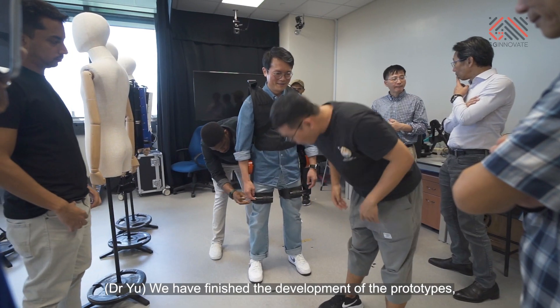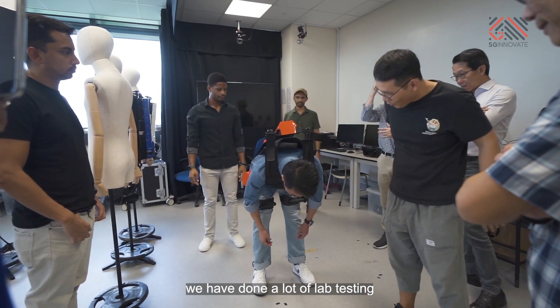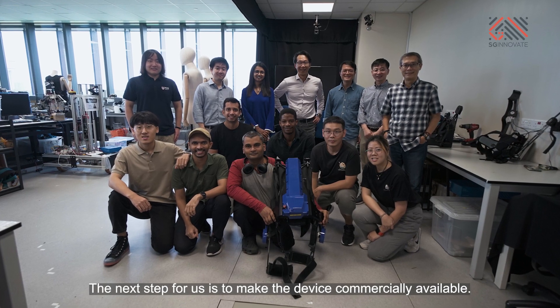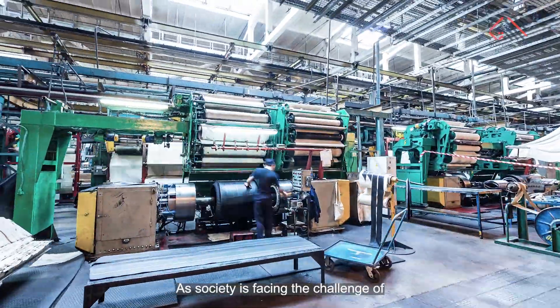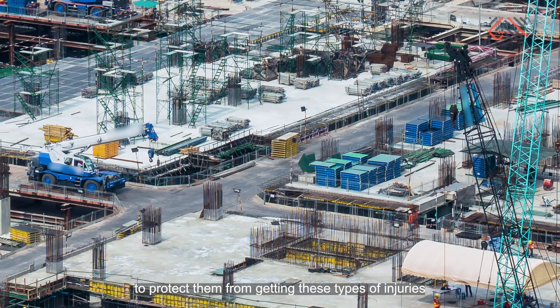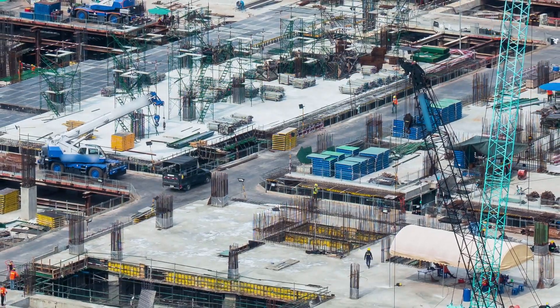We have finished the development of the prototypes. We have done a lot of lab testing and looked at the biomechanics results from all these devices. The next step for us is to make the device commercially available. As society is facing the challenge of aging population, it's more important now to protect them from getting this type of injury so that they can work with quality for a much longer time.